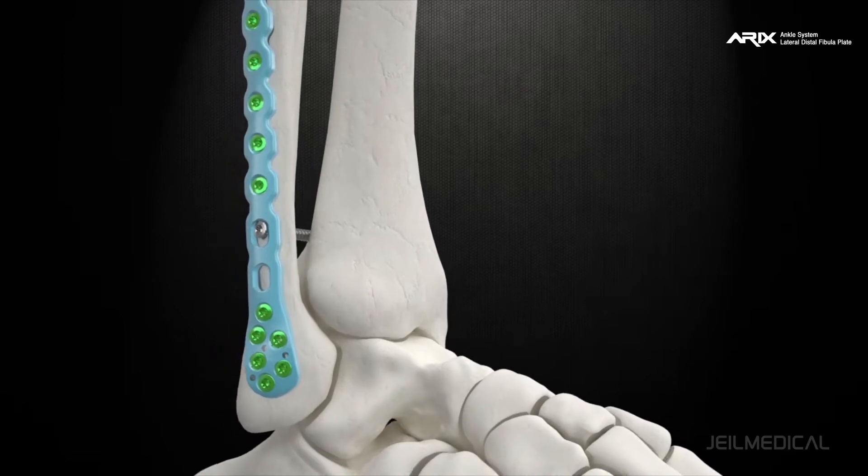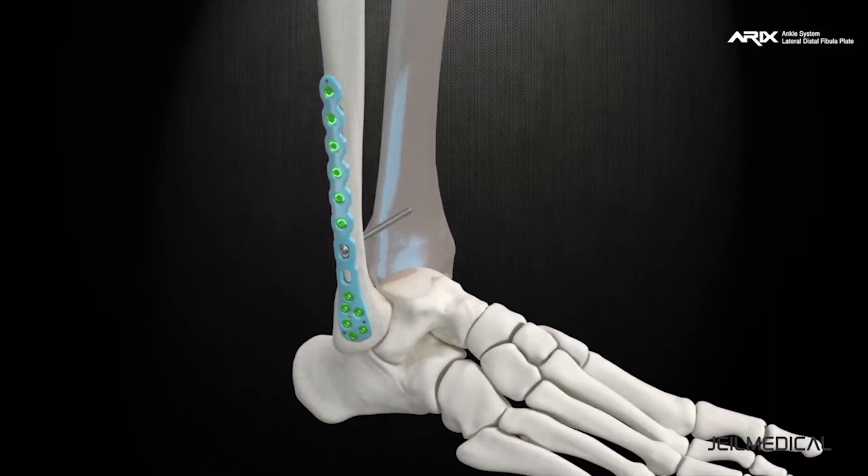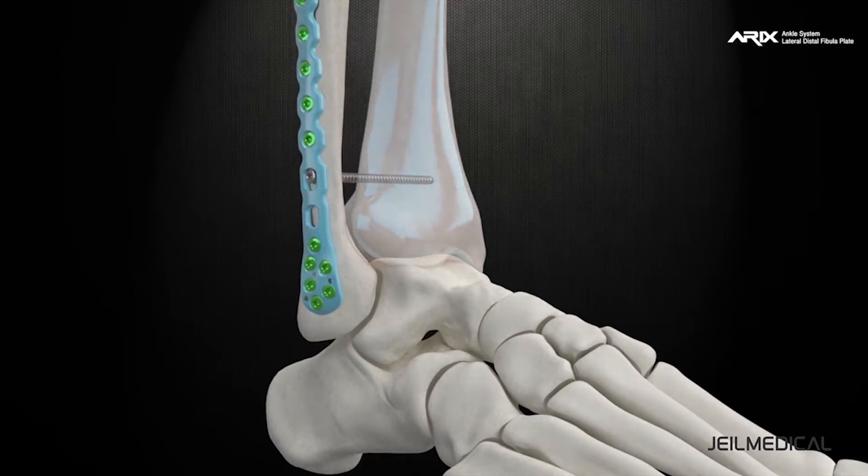Depending on the surgeon's choice, the syndesmosis screw can be used to fix the fibula and tibia, but care should be taken as it may cause fatigue failure.